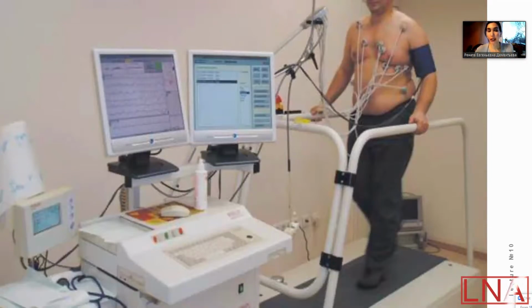It's a picture of a patient with treadmill tests, and you can assess the level. There is some data about the patient on the first monitor, and the level of the loading for the patient, and exactly registration of ECG during all time of this method, during a longer time. And after that, you can print this ECG and take time to analyze. But this method gives you some additional information and will show you where there will be some abnormal elements on the ECG.